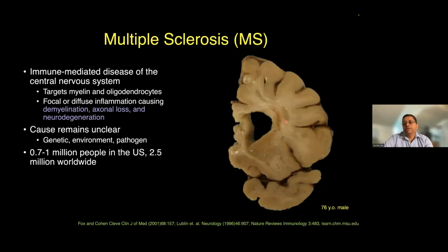With every attack, you can see this pale discoloration in the white matter, and maybe even in the gray matter here, and in the deep gray matter over here. This happens because of demyelination, and this is an attack. It happens in a pseudo-random fashion throughout the brain, and it also happens at different intervals in time. So that is the basis of MS diagnosis.